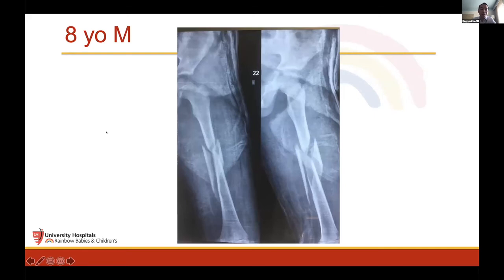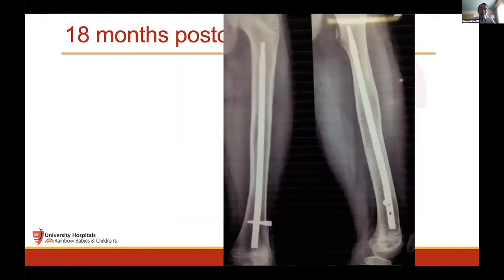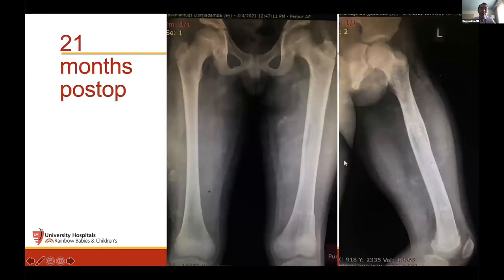Some of my colleagues in Mongolia have done this for their trauma cases. Because of the resources that they have, they don't necessarily have the other treatments that we would offer for this. And they would put in a retrograde nail, as they did here. Upon follow-up, you can see that the relationship of the growth plate to the nail has changed. The nail has essentially drifted up the bone. They take that out, and at 21 months, they don't have any limb length discrepancy in this patient. So it demonstrates that there is some resilience to that distal femur. And we've done a whole case series of theirs showing no growth arrests.